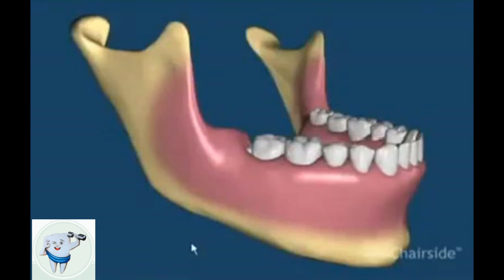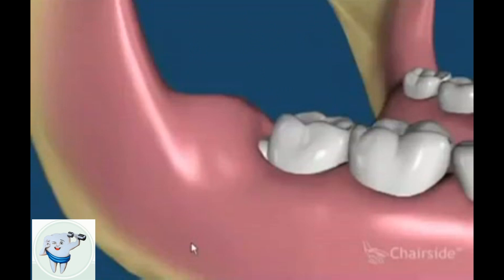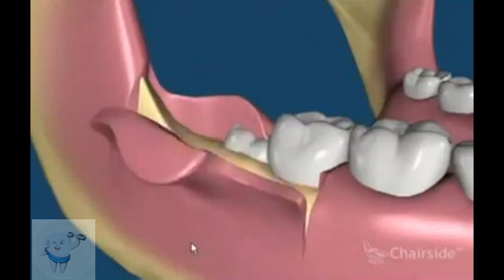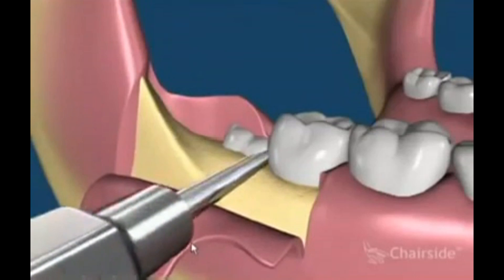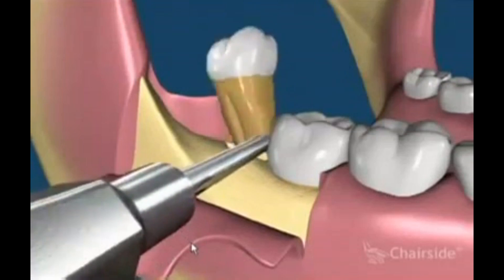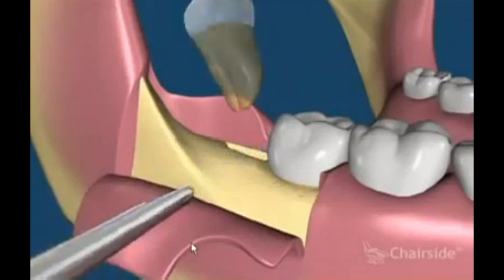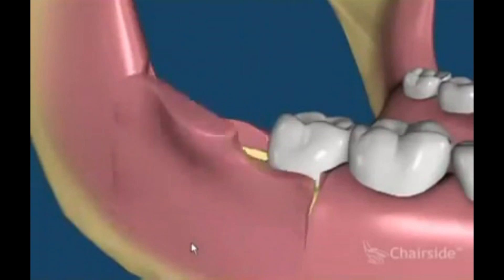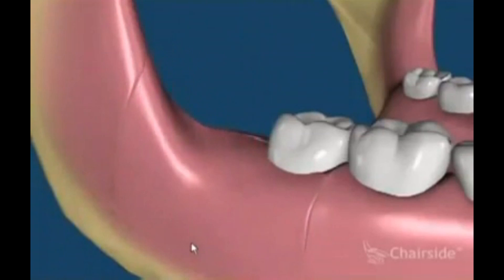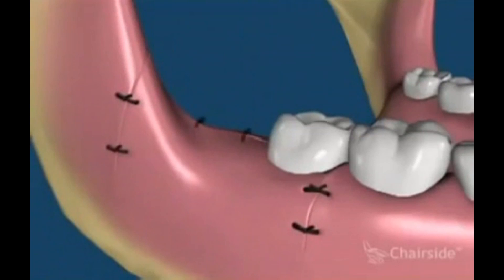This movie shows an impacted lower wisdom tooth. In the soft tissue removal situation, we raise the flap and usually elevate the tooth without removing any bone. The flap is repositioned and sutured into place. The sutures dissolve and the area heals.